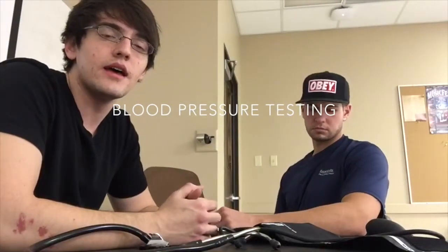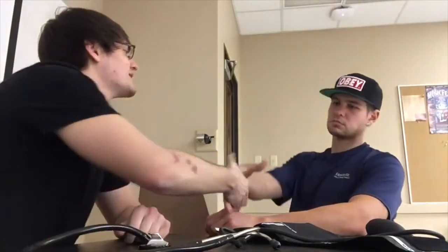Hi, my name's Todd, and I'm going to be showing you how to do a blood pressure test today. So first thing you want to do is introduce yourself to the patient. Hi, I'm Todd. Dylan. Nice to meet you, Dylan.